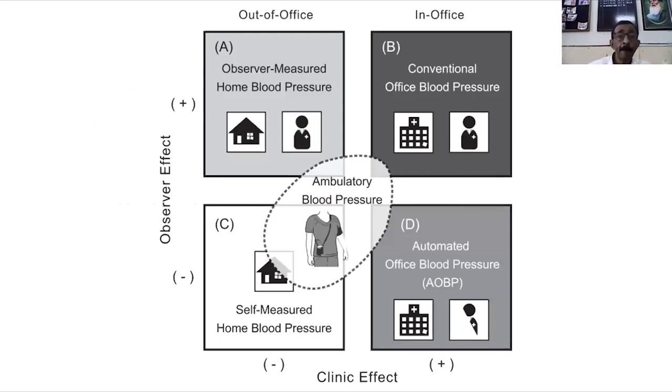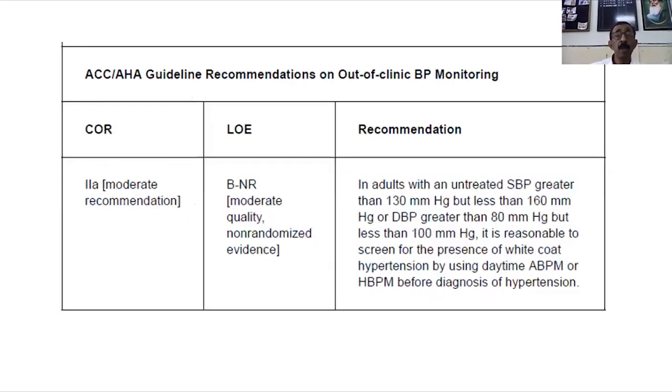Now this slide depicts the various areas where the BP can be monitored, and in the center it shows how ambulatory blood pressure monitoring serves almost all the purposes and is a very good parameter.